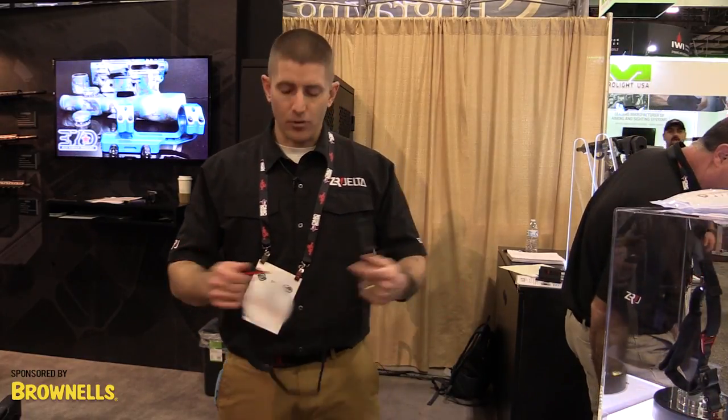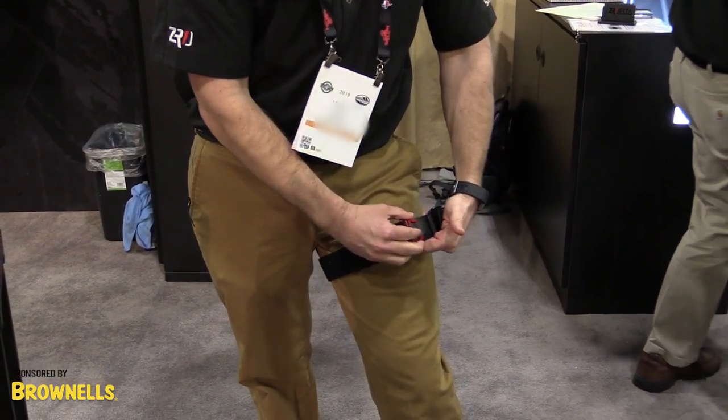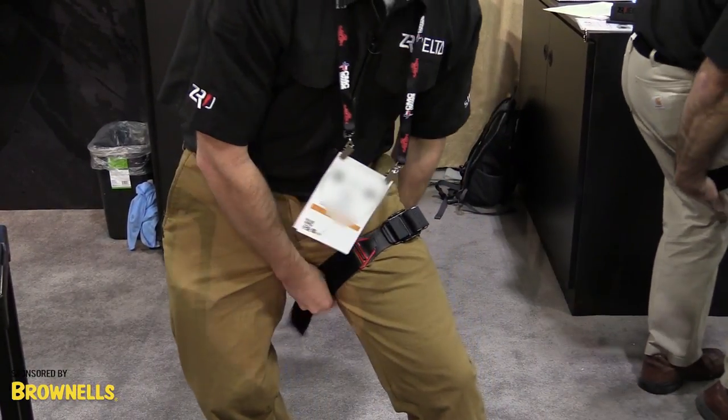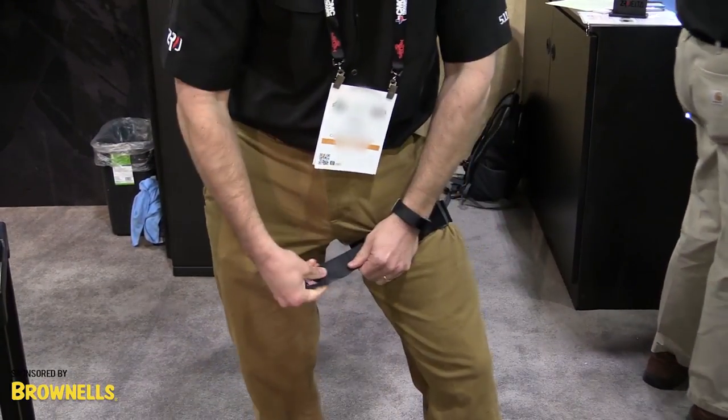Simply remove the red buckle, place around the extremity. Both a tactile and audible click to let you know that you're in place. Tighten the strap, re-adhere it back to itself, deploy your locking tab, move the lever over.